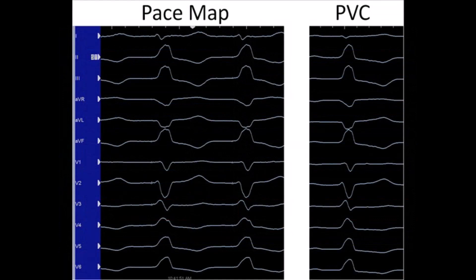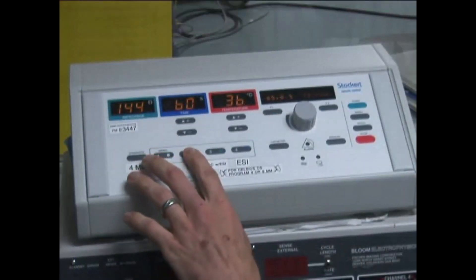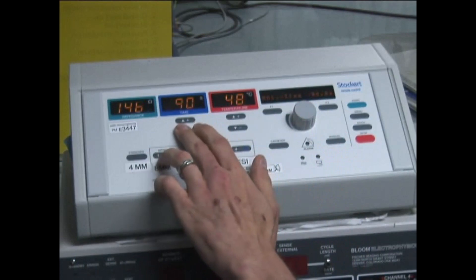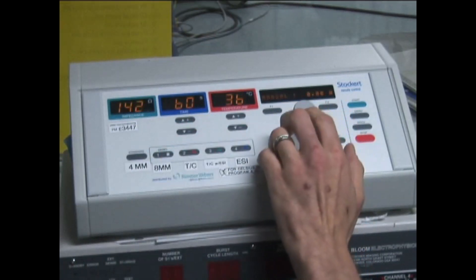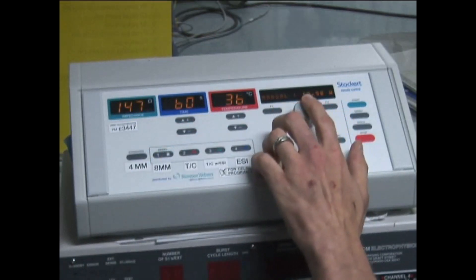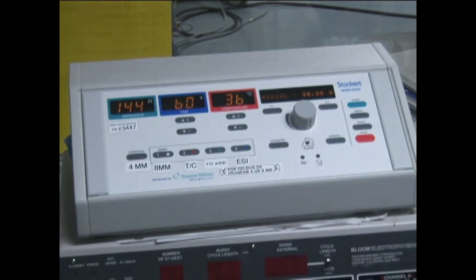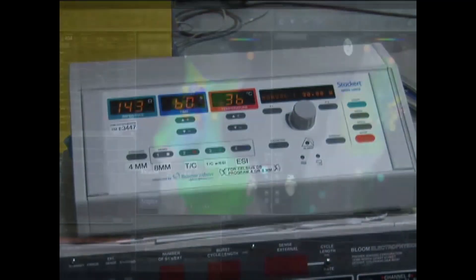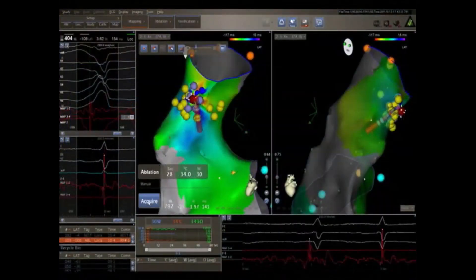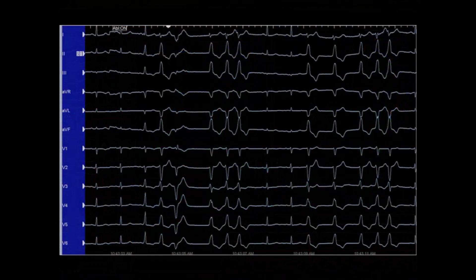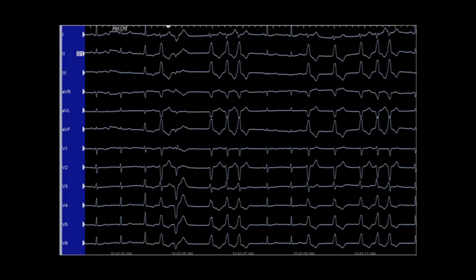For the ablation, the radiofrequency generator is programmed to the desired settings. In this case, using an open irrigated tip catheter, an energy setting of 30 watts was delivered for 60 seconds. The ablation is then started; one or several bursts of tachycardia followed by abrupt termination predicts a successful ablation location.